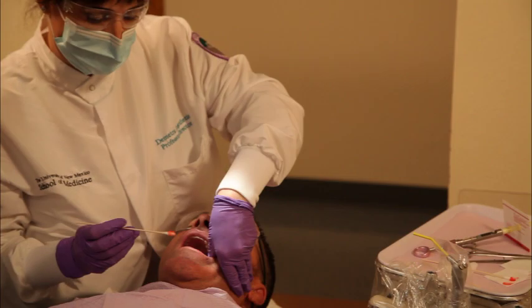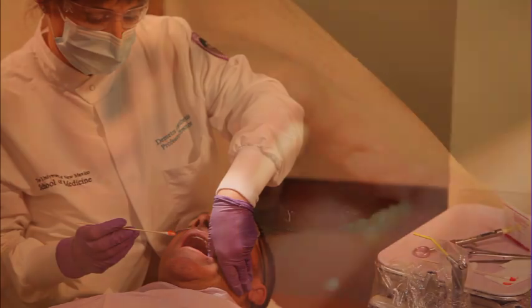For the LB block, assume the correct operator position at 8 to 9 o'clock right side or 10 o'clock left side for a right-handed clinician, or 4 to 3 o'clock right side or 2 o'clock left side for a left-handed clinician. Ask the supine patient to again open the mouth, but not as wide as for the IA block. Retract the buccal soft tissue laterally, pulling the tissue taut.